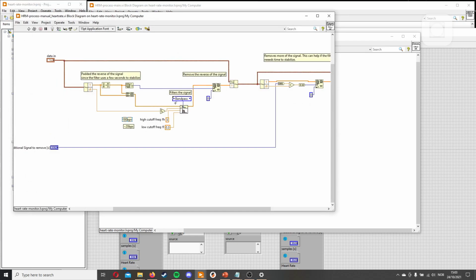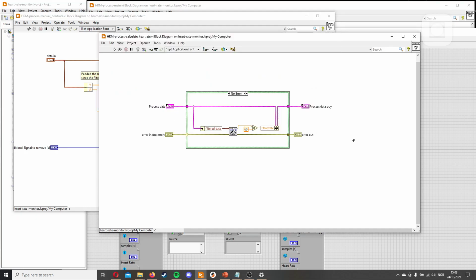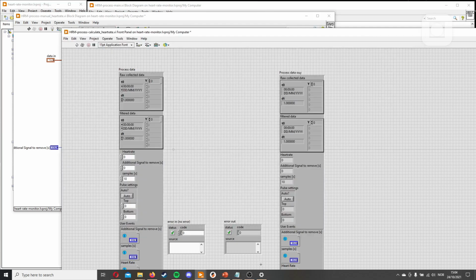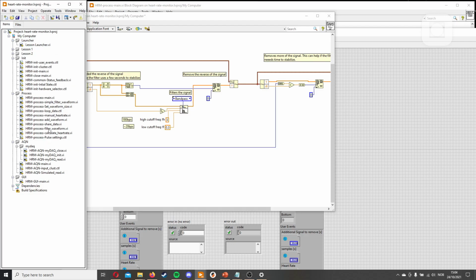And let's go about editing this. We will not have this one out. We will have the waveform in and then the frequency out, because we can reuse this one. And we can reuse the input here. And so this will only replace this little bit here. Now it's getting messy. Okay.